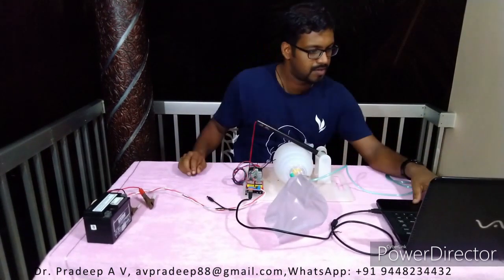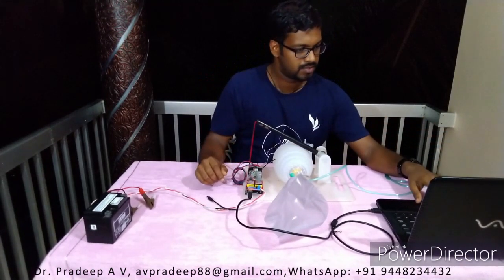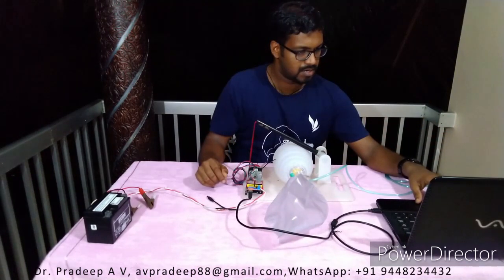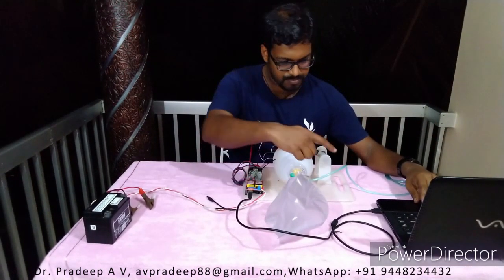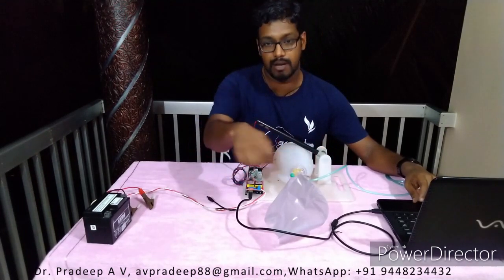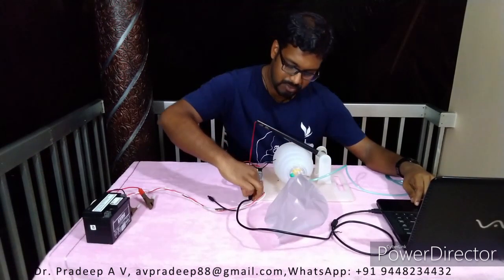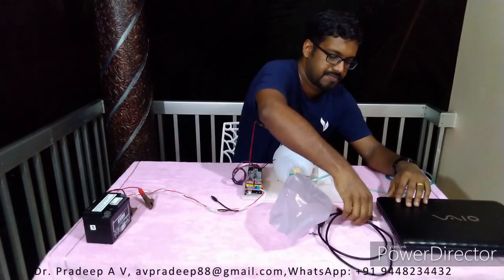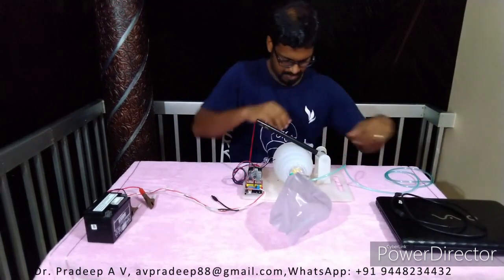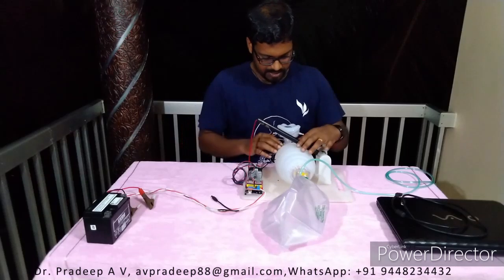Fine. I have already written the program, I just burn it into the board. So go compile and upload. This program is currently uploading through this to this one. Yeah, done compiling, so we don't need it anymore. Fine, we don't need it. For your convenience, I'll keep it like this.